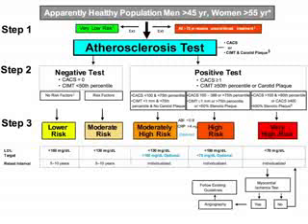And I'm not going to walk you through this whole pathway here, but you can imagine how if you're working in primary care or something, you could take this type of data and combine it with some type of algorithm to decide at what risk your patients are. So if your carotid intimal medial thickness, here it is, is less than 50th percentile or greater than 50th percentile, or you actually visualize a carotid plaque, which is an actual part of the carotid artery that is severely narrowed from a plaque on it, then there's other factors going on here.